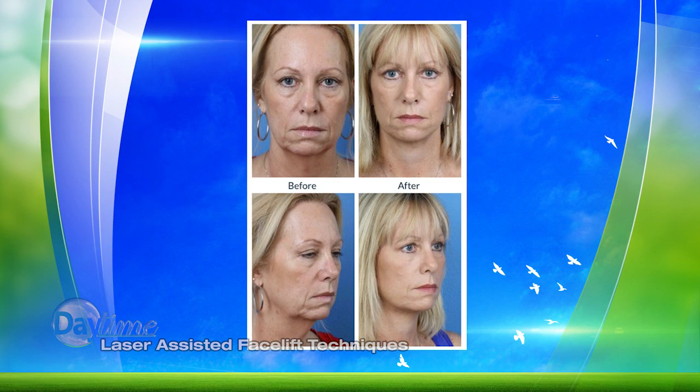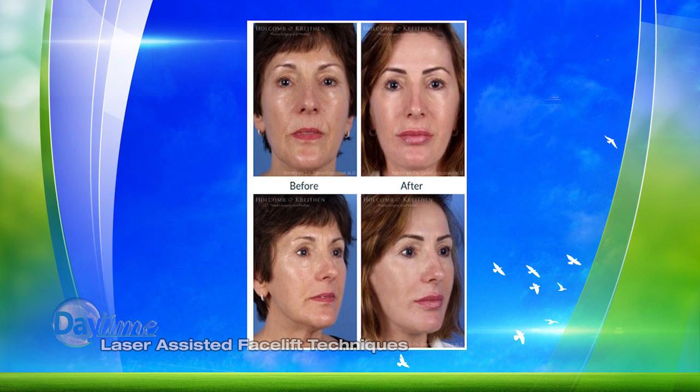I'm curious, does the laser resurface the skin as well? Yes, so not that particular laser. Okay, this is something else. But patients do have that done at the same session many times. So we use the fiber laser to contour the lower face and neck, do the lifting part. At the end, we will use a different kind of laser, whether it's an erbium YAG laser or a fractional CO2 laser, sometimes both, to tighten the skin, remove wrinkles, and improve the skin tone and texture.